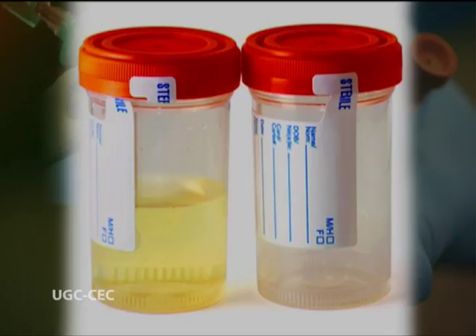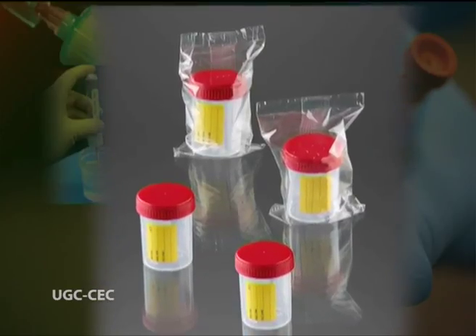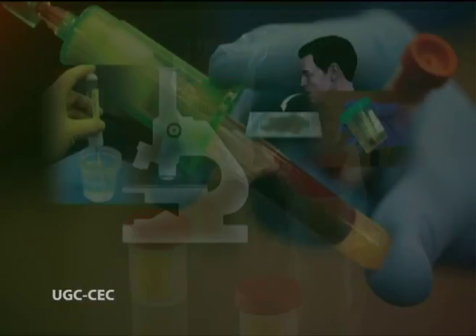In the male, encourage retraction of the prepuce if appropriate while passing urine. Instruct the child or young person that the remaining urine can pass into the toilet. Place the lid securely on the specimen container. Wipe the outside of the container with a sanitizing wipe and place the container in a polythene transport bag.